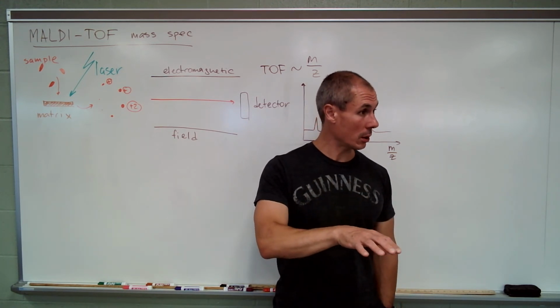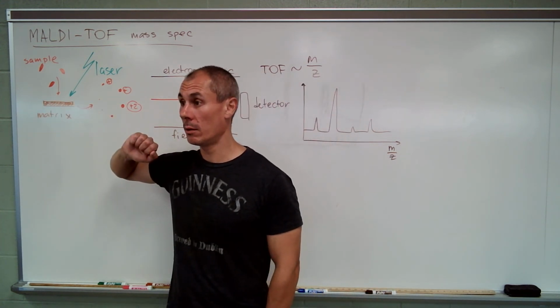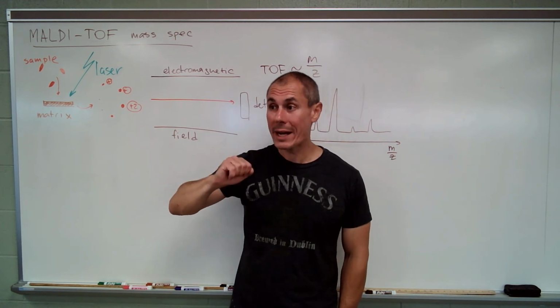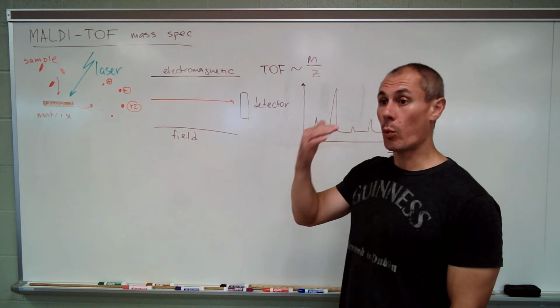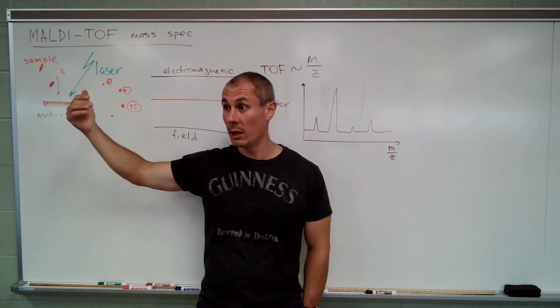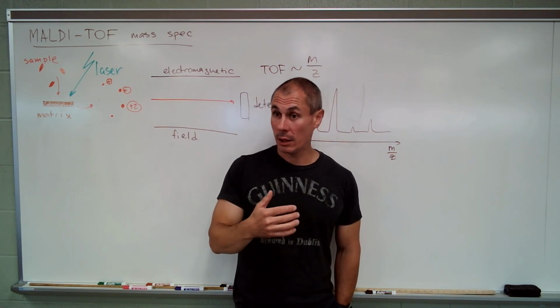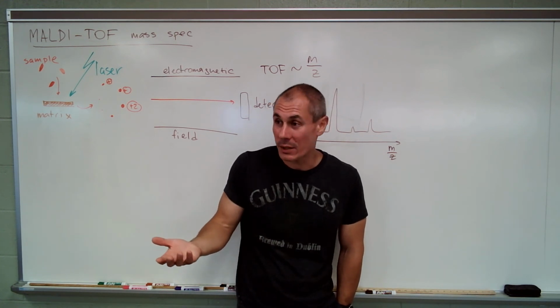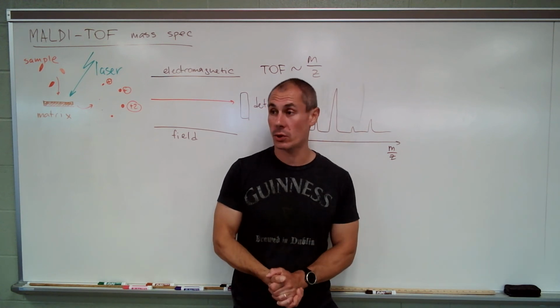Once you have the pure culture, you get the sample of your culture, load it here. From what I know now, it's 20 minutes. In 20 minutes, you don't even need to look at the graph. The machine will compare the graph that you got from your sample and the graphs that it has in the database. And if it finds the matching, basically like fingerprints, if it finds the matching graph, boom, you've got the answer.